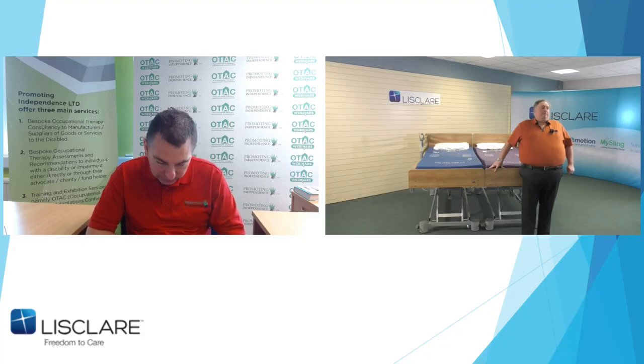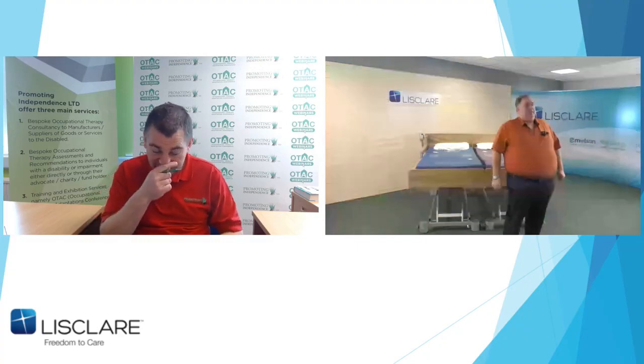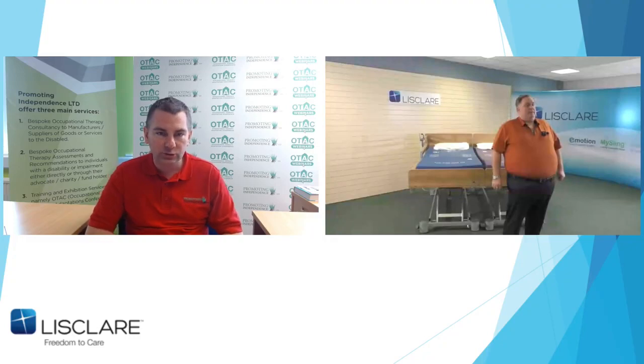Some of the questions are quite lengthy, so apologies. I really like the idea of the bed rails being split to accommodate support for a person to complete bed transfers, as we are unable to fit bed levers onto profiling beds. Is that still the case, Keith, that you can't fit a bed lever onto a profiling bed? Or would you still advise against it?